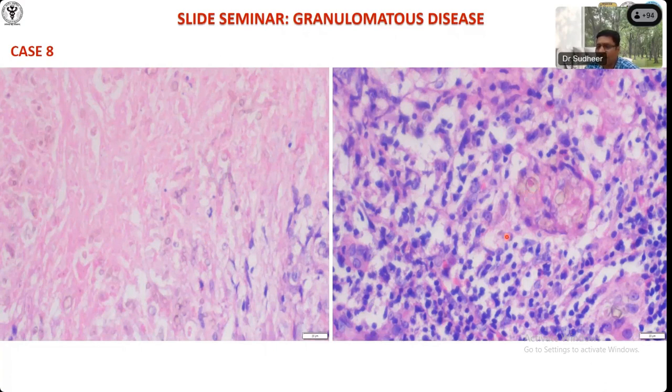Sir, ingested RBC. They have some color to it. How many fungal structures have you seen? On H&E, most fungi will have eosinophilic-like structures. But what are these structures? Which color are these? Brownish. Whenever you see brownish color in the fungi, that is called a dematiaceous, pigmented fungus. The pigmented fungus you have to identify.